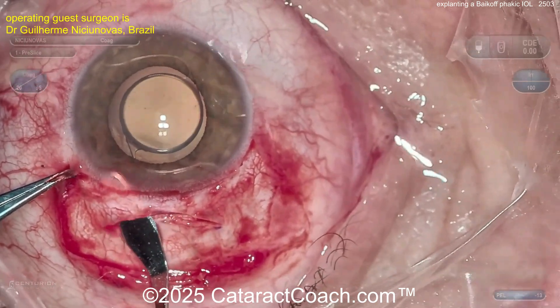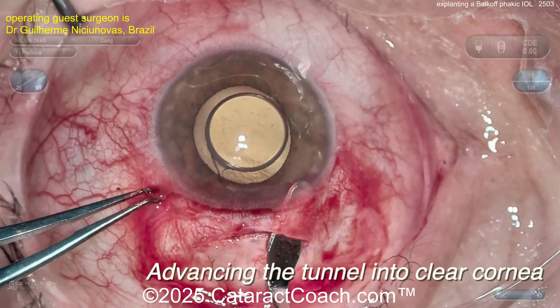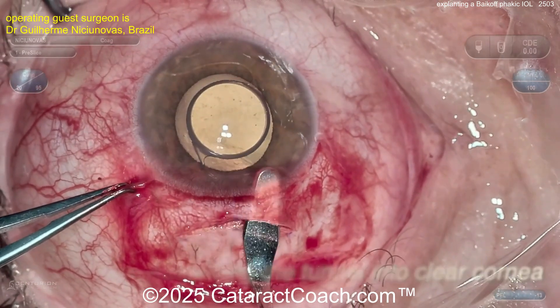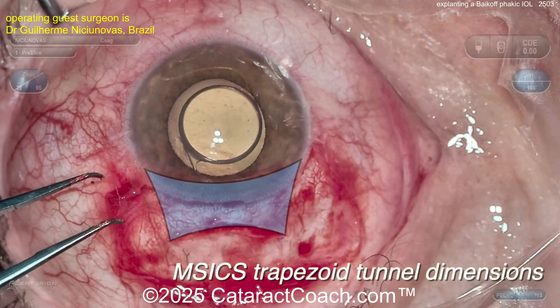You need a wide incision because this lens is made of a rigid plastic that you cannot fold and cannot cut. Now you've got the tunnel into the clear cornea, and you can enter the eye and remove this lens in whole — it comes out pretty easily. The incision is trapezoidal, wider on the inside than on the outside. Seven millimeters is good to remove this phakic lens.